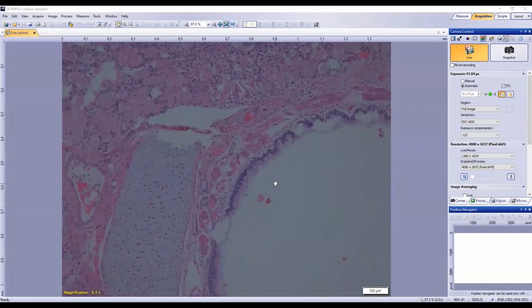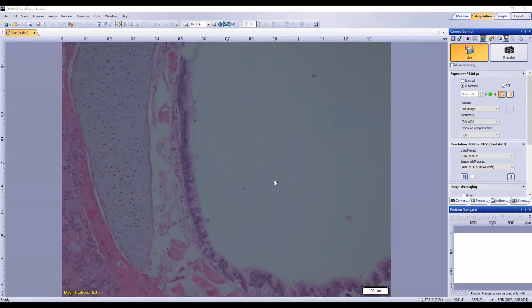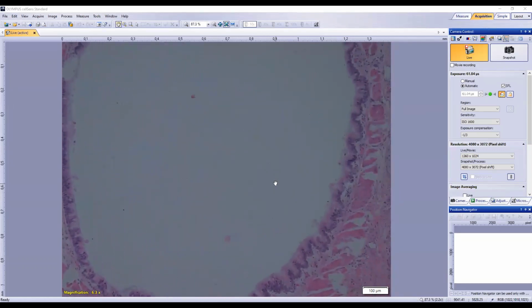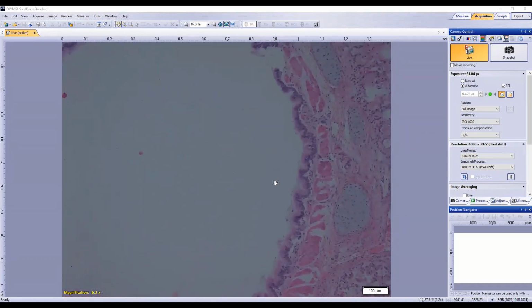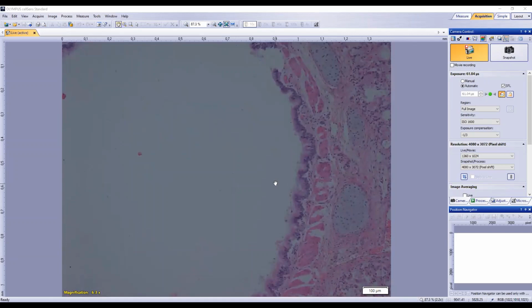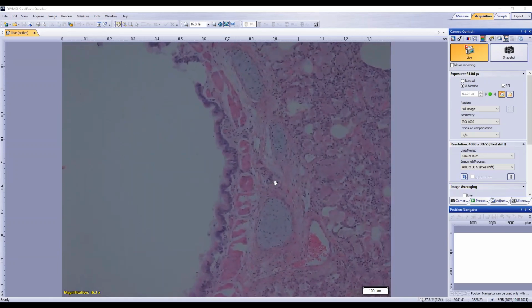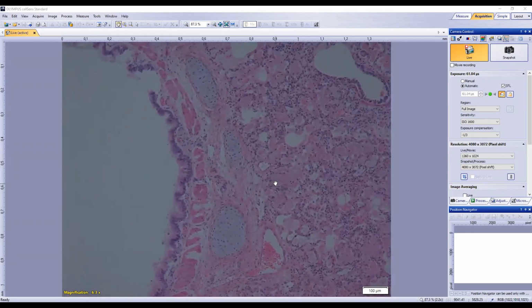Is it enough just to have necrotic material and inflammatory cells within the lumen? No, exactly. Because we want to see that the process is actually targeting the bronchi and the bronchioles to call it a bronchointerstitial pneumonia. Cool. So we've got an interstitial pneumonia in a 3-month-old horse. What are some of our differentials?